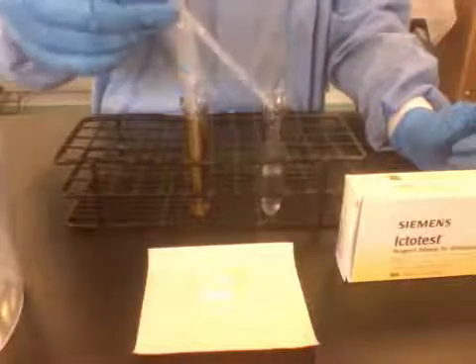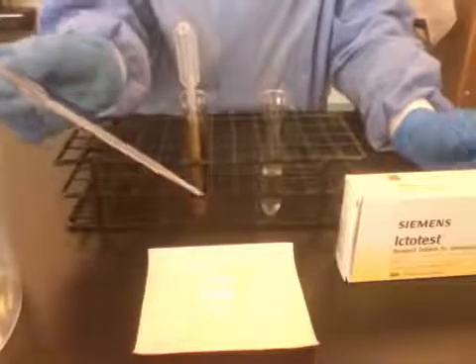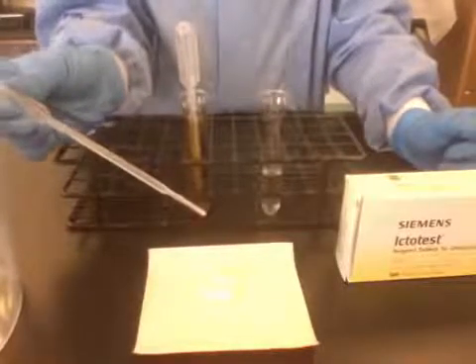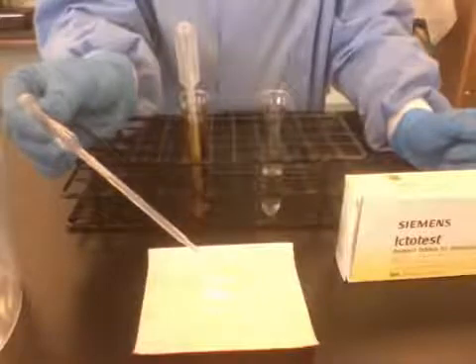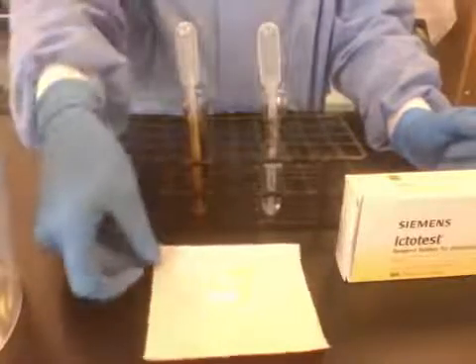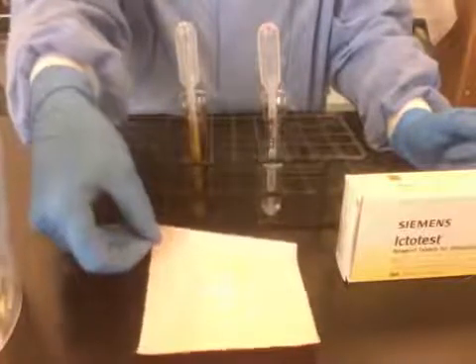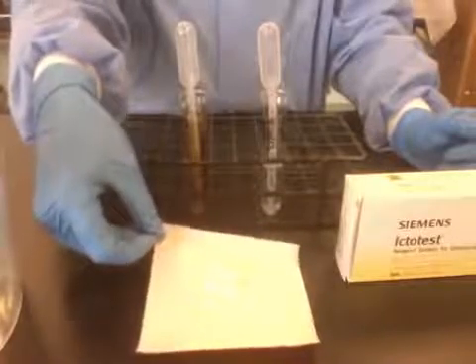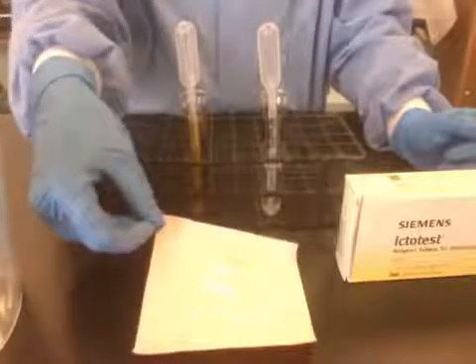Now we are going to add one drop of water to the tablet, and then one more drop and let the color run over. A positive reaction is going to be a dark purple, indigo color, whereas a negative reaction is either going to just stay yellow or be a sort of pink-red color.